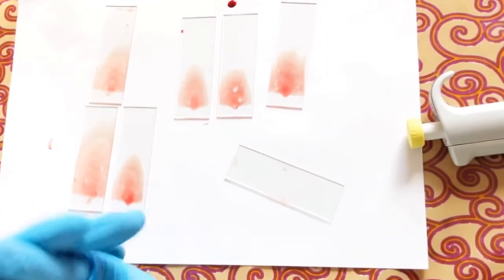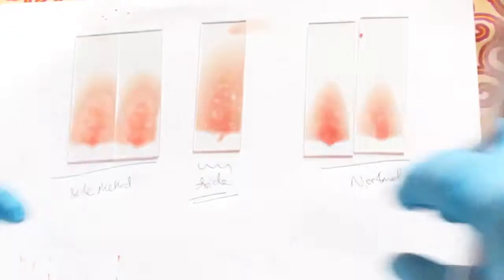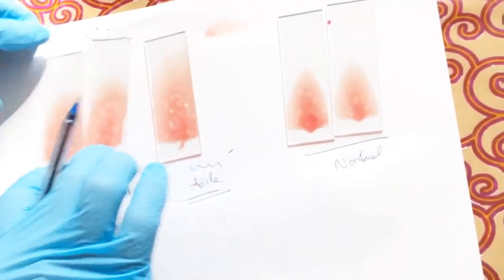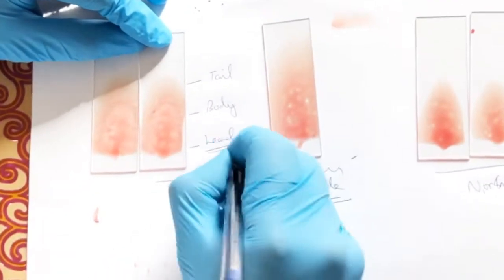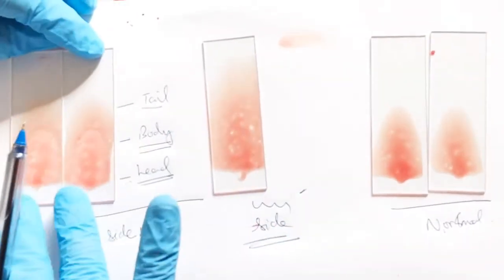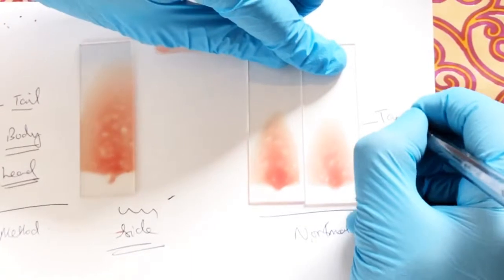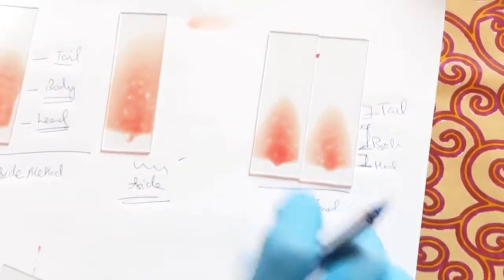Comparing all the slides: the two tongue-shaped ones were prepared using the standard 30-degree edge method, while the three others used the side method. Among all of them, the two tongue-shaped slides are best because they show a clear three-section division — tail, body, and head — with lighter, mid, and darker shading respectively. The side-method slide can also be used, identifying its head, body, and tail regions for analysis.